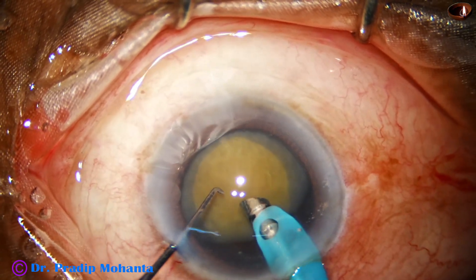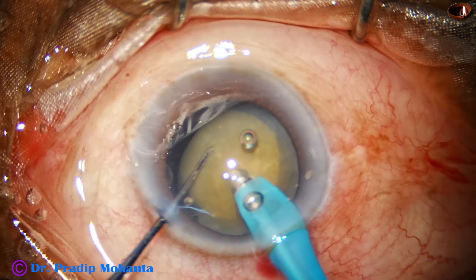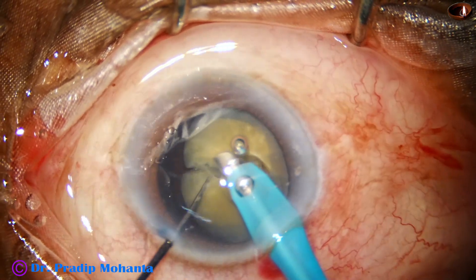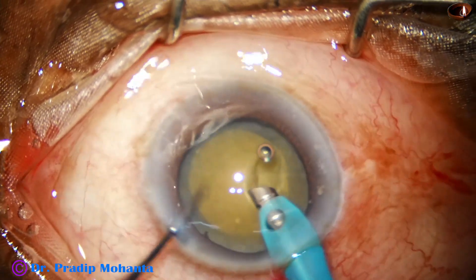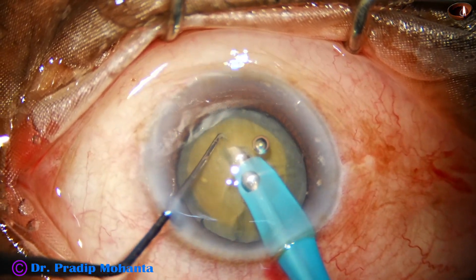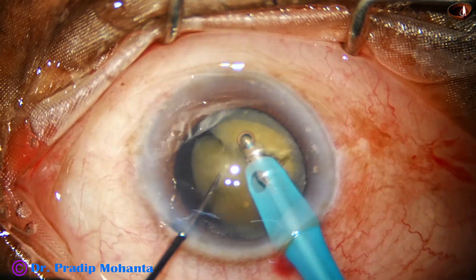I go bevel down, a little sideways, go into the substance of the nucleus, hold it very nicely and get a nice crack. Everything is going well at this time. Rotate, go to the other side, again bury the teeth in the substance of the nucleus, hold it very firmly and get another crack.